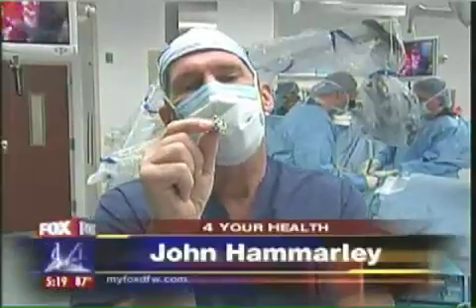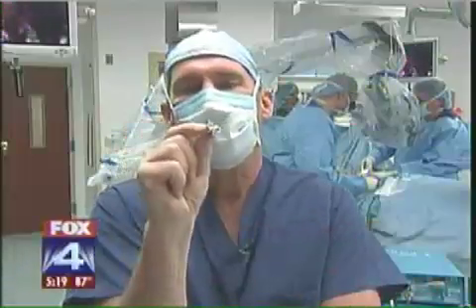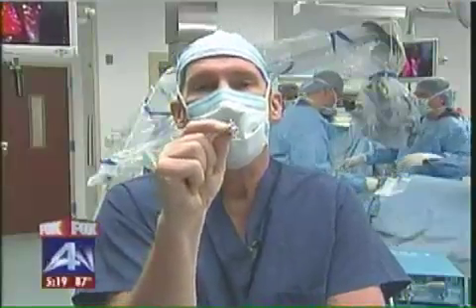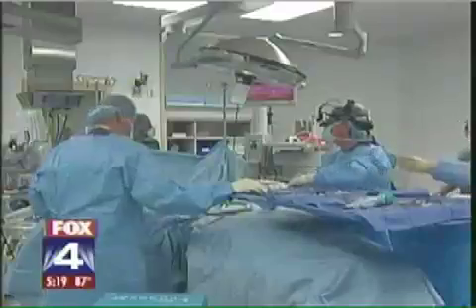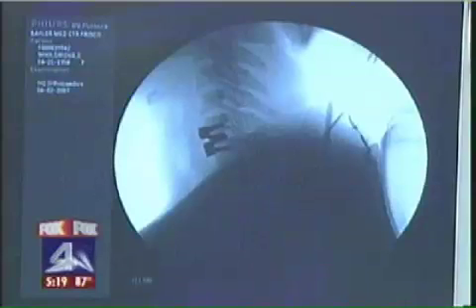Because the whole point of the implant is to keep things moving as naturally and as freely as possible, the patient is going to go home within 24 hours of her surgery, and she won't have any type of brace at all. The patients who have disc replacements do better faster. They get more pain relief quicker, and their disability scores were much improved compared to the fusion group at 6 weeks. So they got better faster, and they got back to work faster.